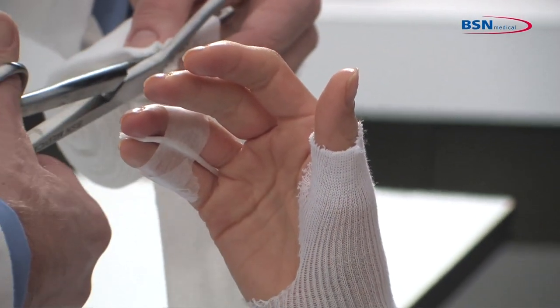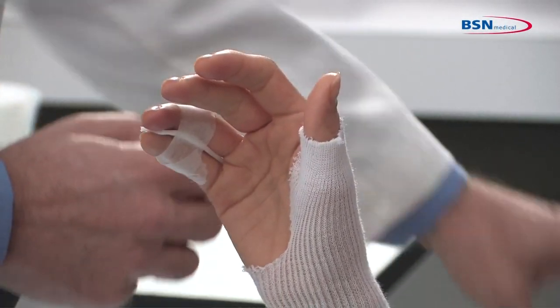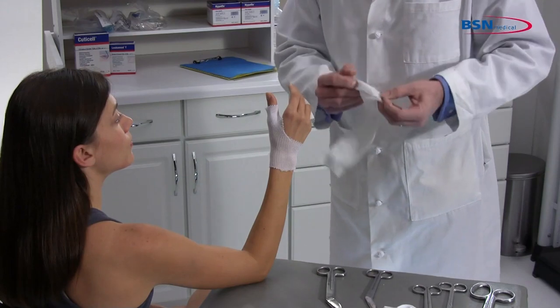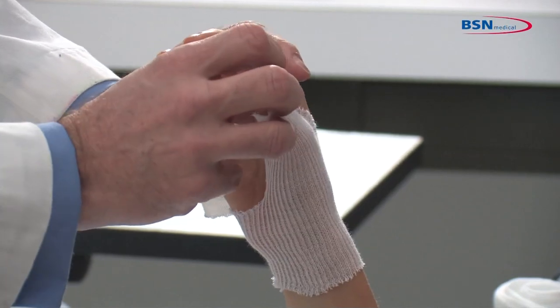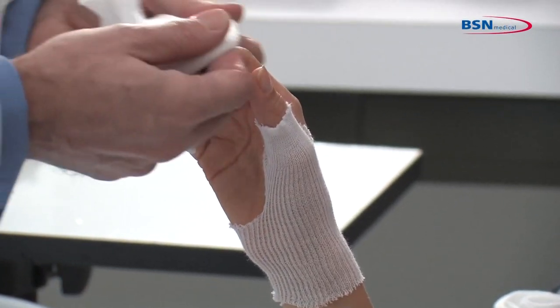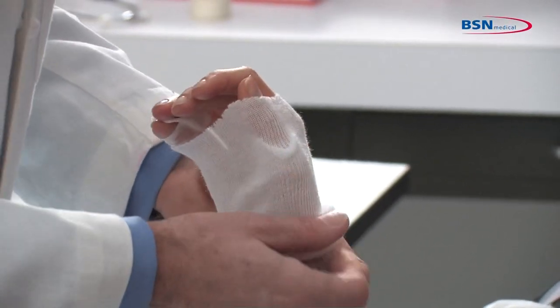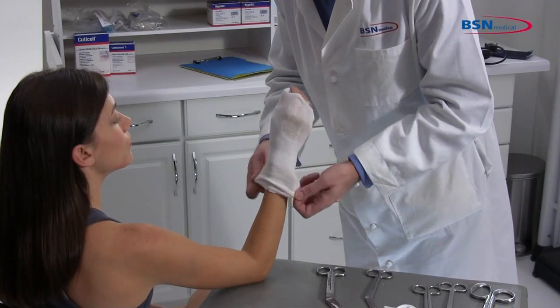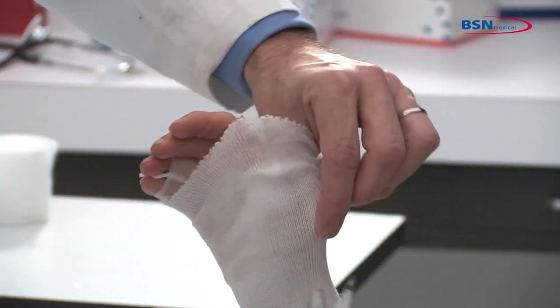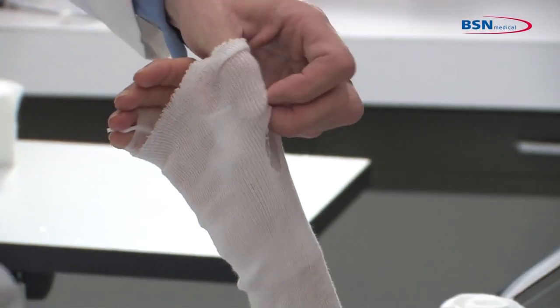Measure from the metacarpals to mid-forearm, allowing enough excess for foldback. Roll up the stockinette before applying to the limb to lessen pressure while applying. Roll on and remove all wrinkles and creases. Make a small cut to allow the thumb to pass through.